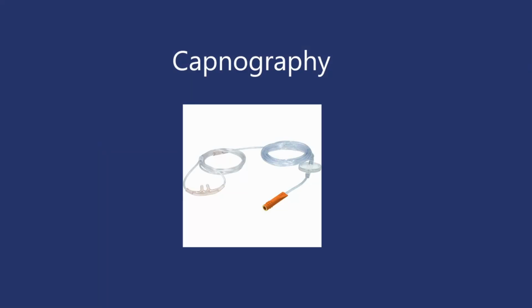All right, so for this, we're going to start talking about capnography. Capnography definition is we're talking about exhaled carbon dioxide. We're measuring carbon dioxide that somebody's breathing in or out.